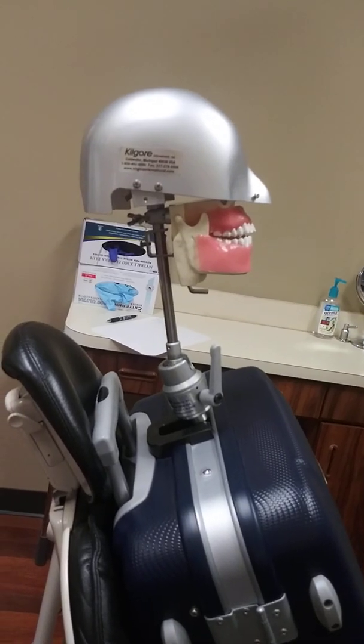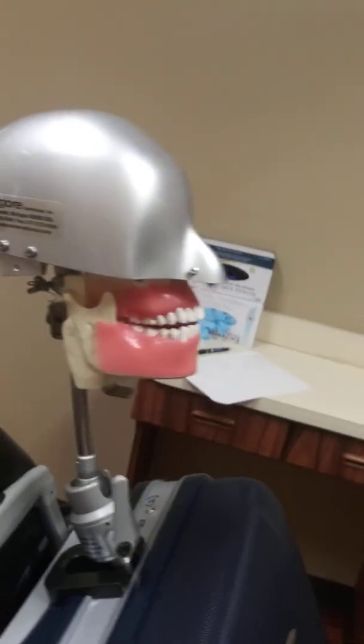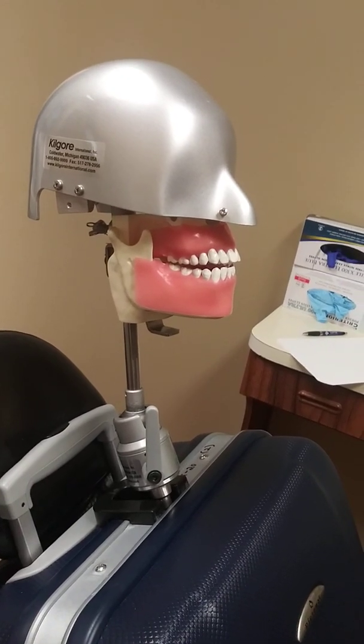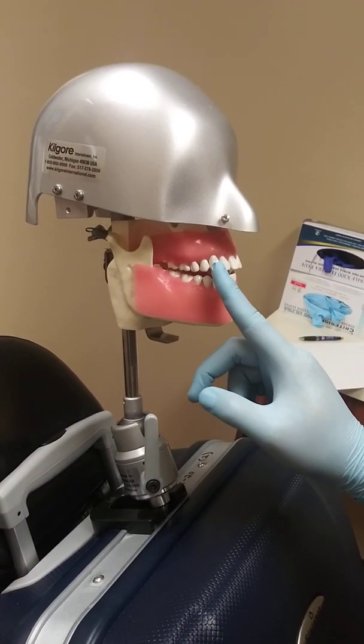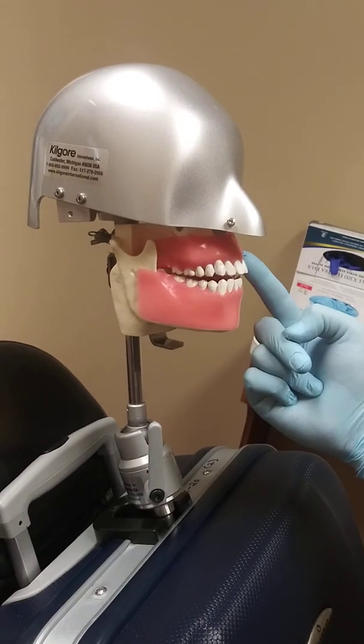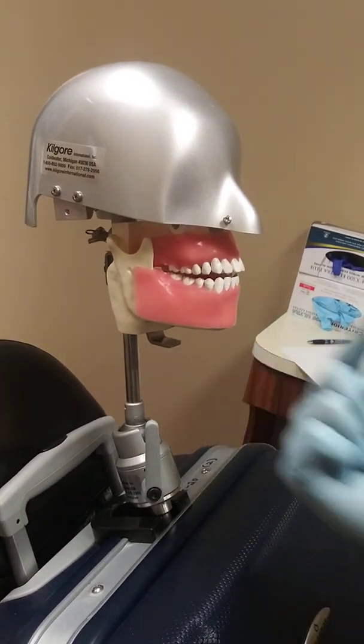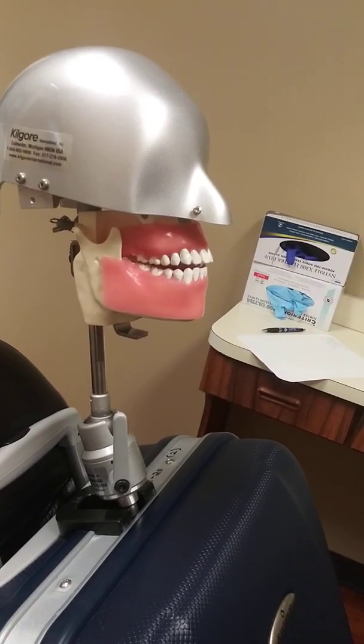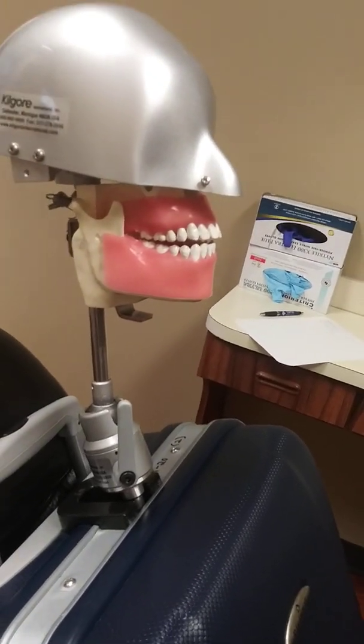What we want to do is distinguish where we're going to be taking this x-ray. If you remember, this is blue, which means it's for an anterior PA — which means we will be taking an x-ray either from this cuspid to this cuspid, or the lower cuspid to the other cuspid. We will not be taking any x-rays on the posterior teeth; that's for the yellow. We are using the blue.